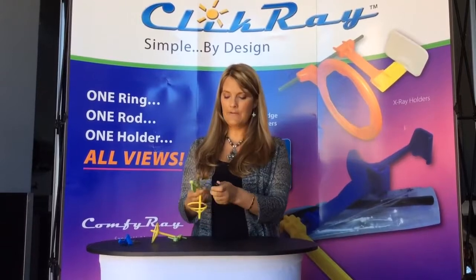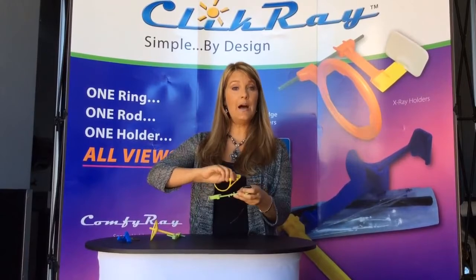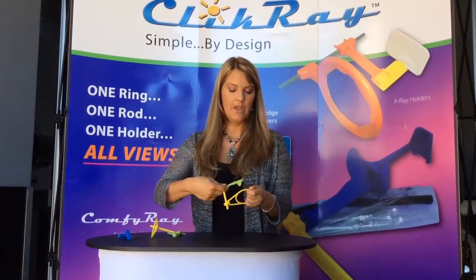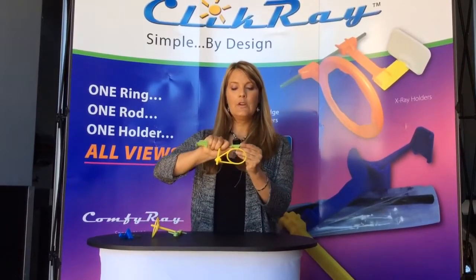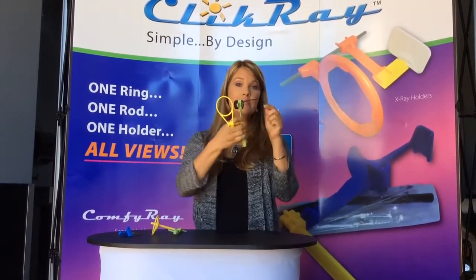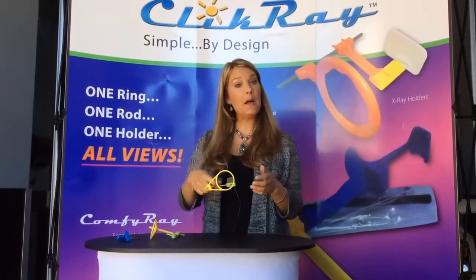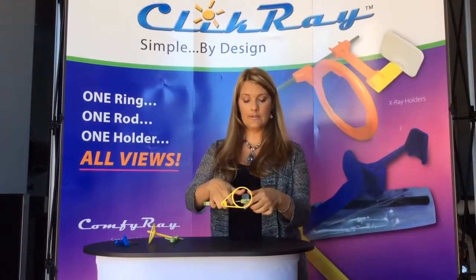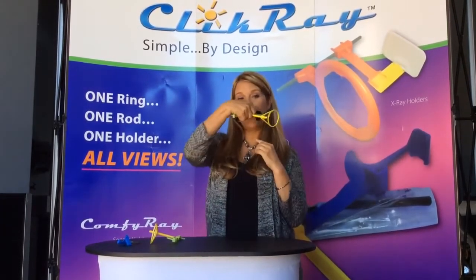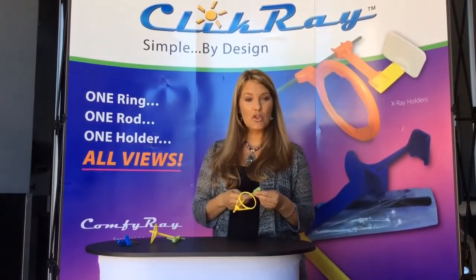Then we're gonna pop our sensor out, and we're gonna go to the anterior position. We're gonna slide the sensor in, pop the rod out, and literally flip it over and tuck it back in, hanging on to that. We're gonna click this into the highest position, slide our sensor to the highest position, and take our anteriors, 1, 2, 3, 1, 2, 3. We get a lot of questions also about vertical bite wings. So a very easy thing to do with this system as well. You're gonna slide your sensor to the middle, click your ring to the middle, and you're able to take vertical bite wings.